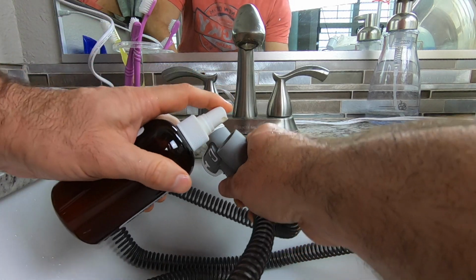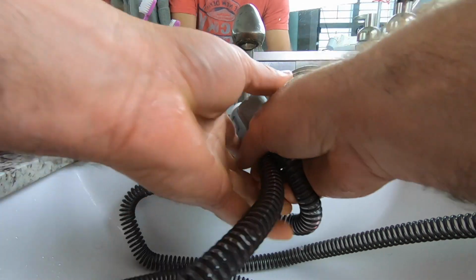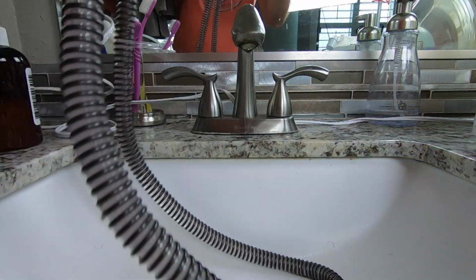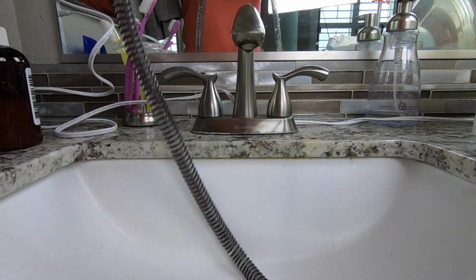Well, you just simply hold it sideways, spray a few times in there, and then we're gonna fill it up with just a little bit of water. And now we can cap both of those ends and we can kind of slosh it around.